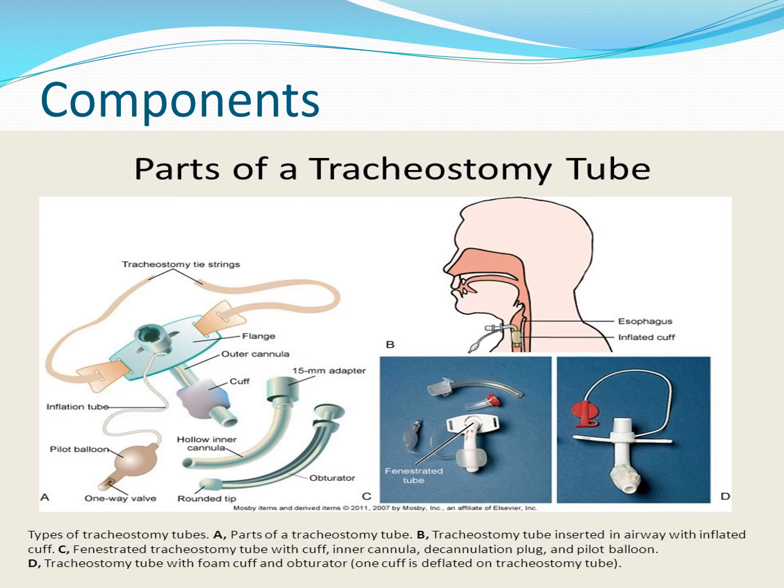And then you have the inner cannula, and near the bottom center you have what's called the obturator. The obturator has a blunted end that protrudes through the end of the tube to better facilitate the insertion and to minimize or eliminate any trauma from the insertion.